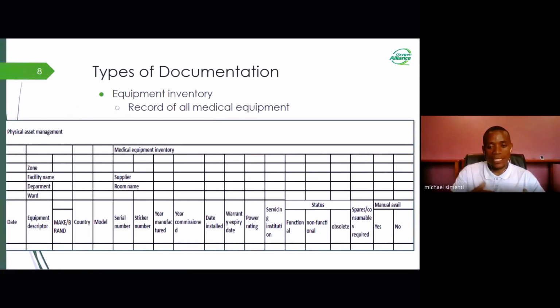It includes details like the name of the device, the model, the serial number, the location where you can find that equipment, any maintenance history that has been done on that equipment, any relevant information about testing or calibration, and any materials, that's the spare parts and consumables, that have been used.